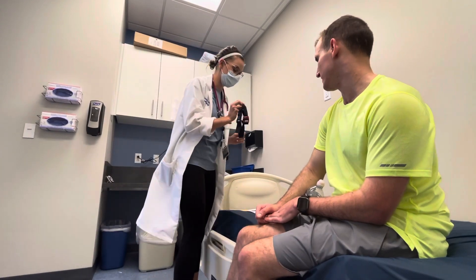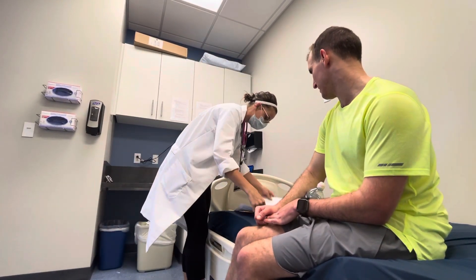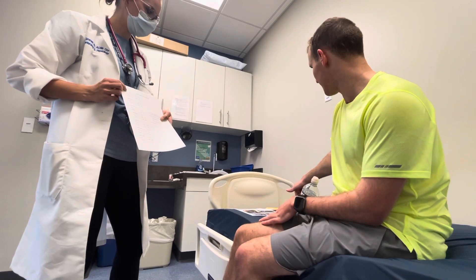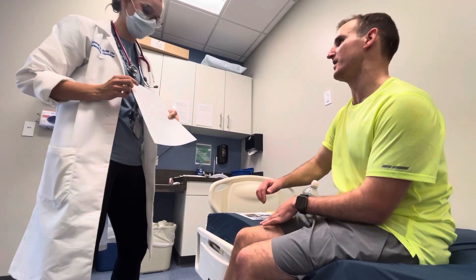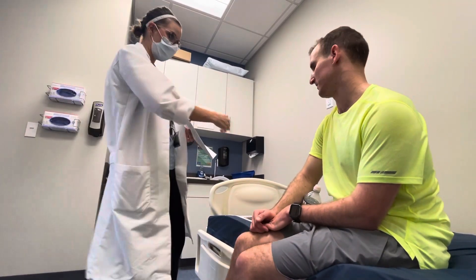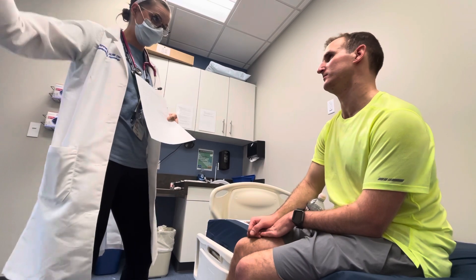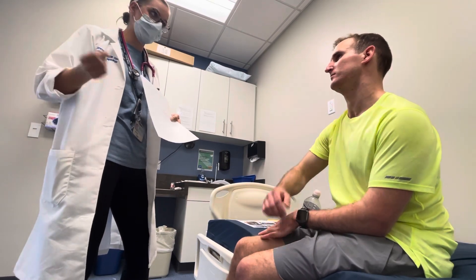This is not waterproof, so you want to take it off when you get in the shower. From the time he wakes up till he gets in the shower. Tomorrow morning you're going to write the date on here. You don't wear this overnight — so you're going to wake up in the morning, grab it, put it on, and write what time that is. When you're ready to go to bed in the evening, write what time you're taking it off, set it next to your bed.